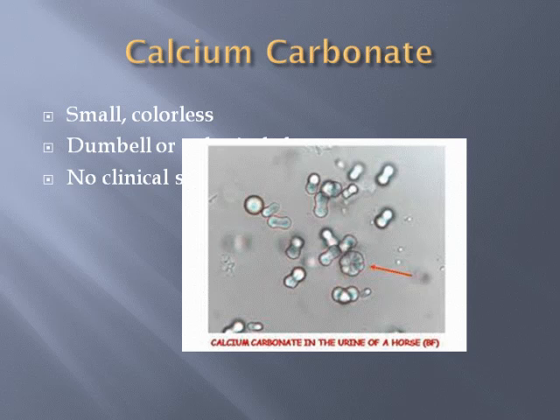Calcium carbonate. No clinical significance. I apologize, the image didn't get moved over. They're small, they're colorless, they kind of have a dumbbell shape or a barrel shape. So these are calcium carbonate.